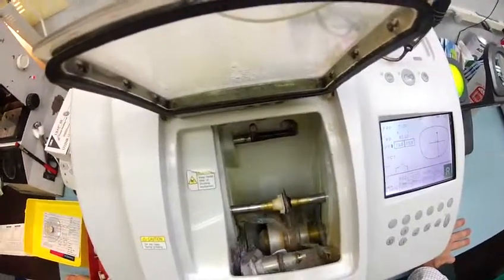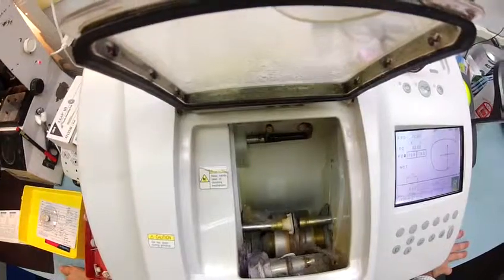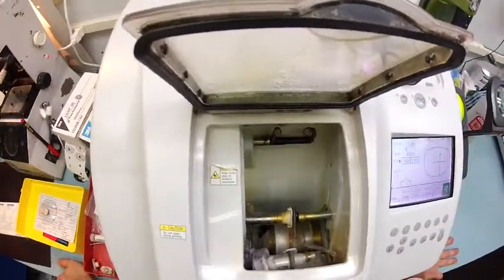It's going to bypass the cutting wheel and go straight to the bevel wheel and go round and round until we get it down to the correct size. Once both lenses are mounted, we're going to activate them, turn them dark so you can see what they look like.